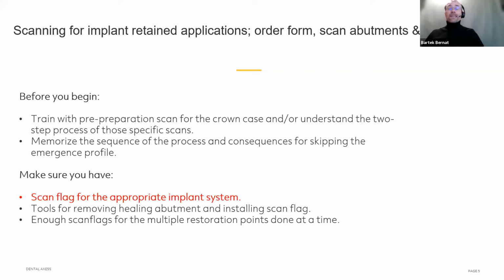consequences for skipping one of them, which could be quite bad. So make sure, and this is really serious stuff, that before your scan you have the scan flag. Without the scan flag, we cannot scan, obviously, for the implant case. And I saw many cases where people were having problems with that. So make sure you have it in hand.